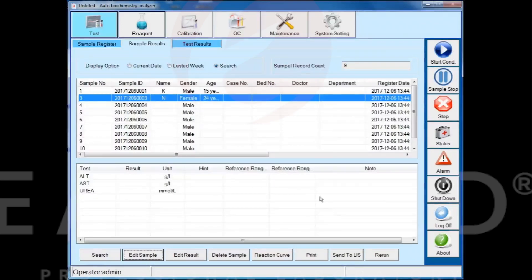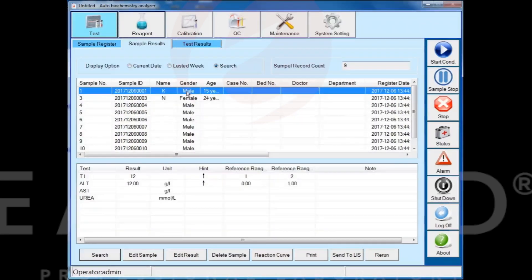Select one sample information, click the edit result button, and you can edit the sample test results.